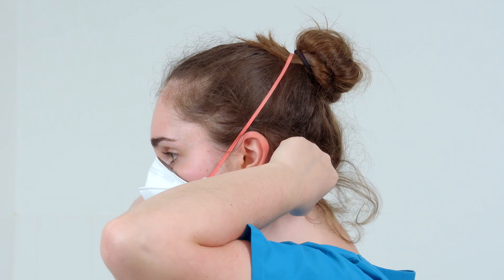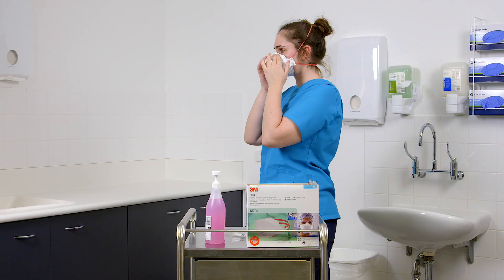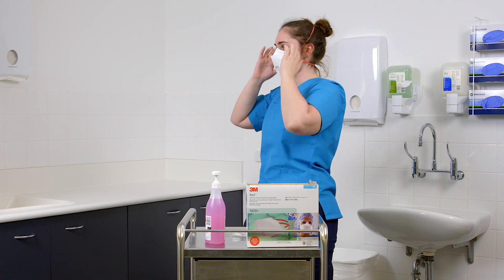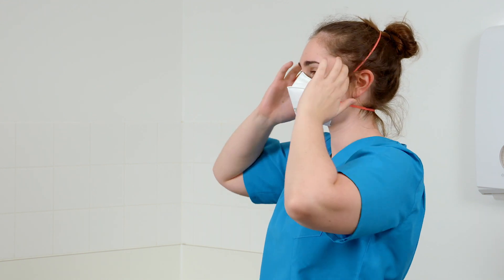Adjust for a comfortable fit by pulling the top panel toward the bridge of your nose and the bottom panel under your chin. Make sure that hair, facial hair, jewellery, and clothing are not between your face and the respirator, as they will interfere with the fit.